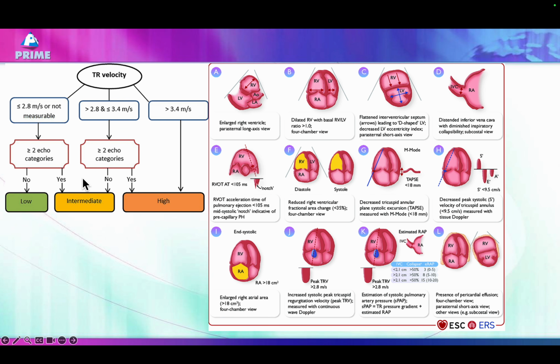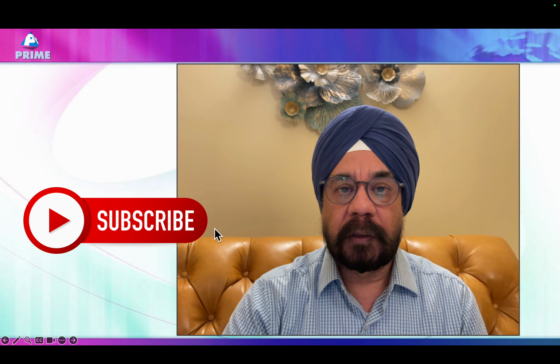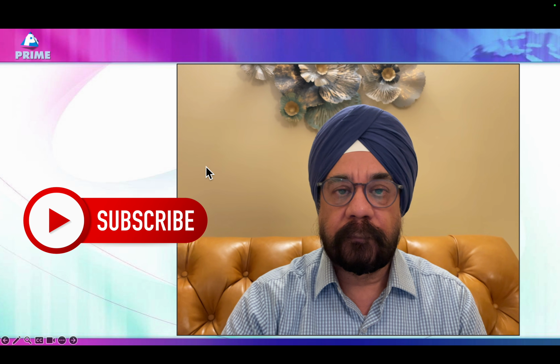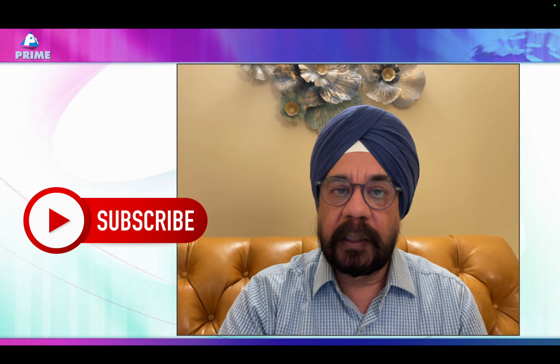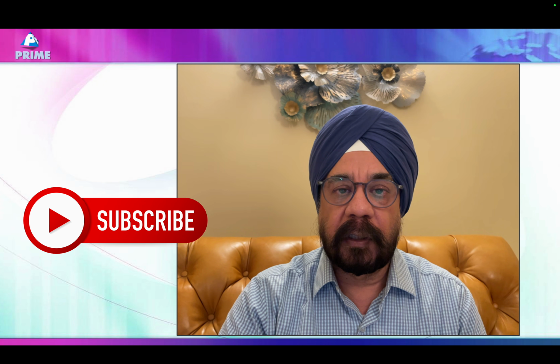If there are 2 parameters, then it becomes the intermediate category, or in the intermediate category, if there are 2 parameters present, it jumps the category from intermediate to high category. So we can only say probabilities, not the PA pressure, because we are more than 50% likely to be wrong. I hope I was able to elaborate the point and got you to an area where these are the recent guidelines which recommend that you should not use PA pressures, you should use the probabilities of a person having PAH.